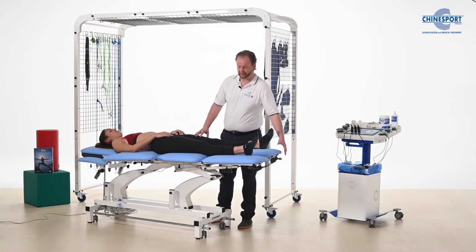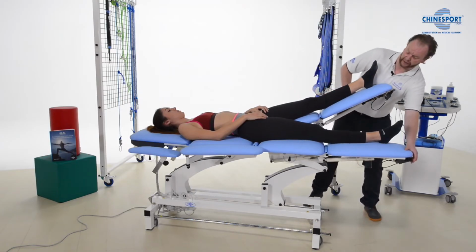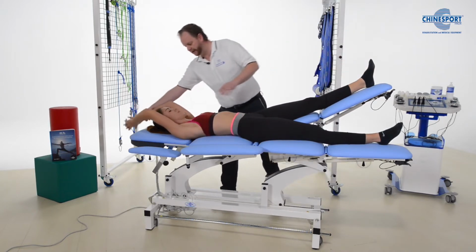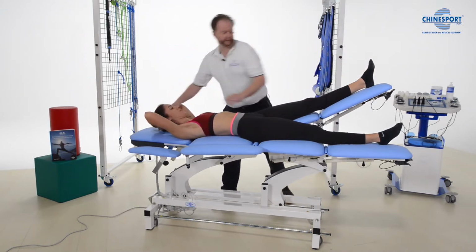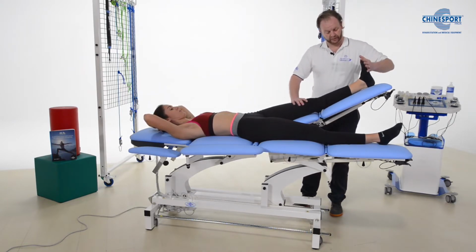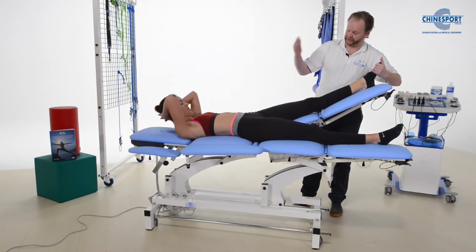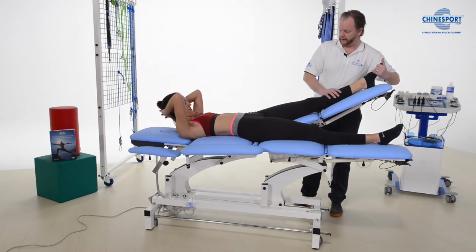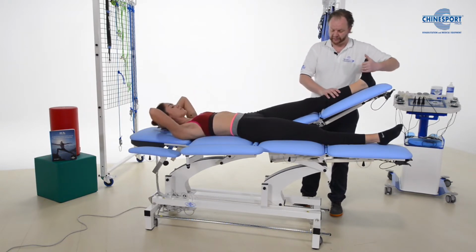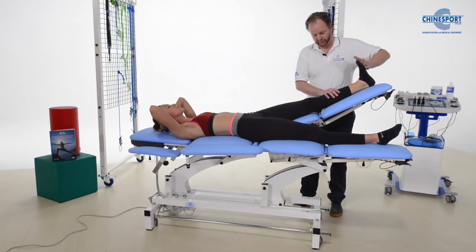So what we could do here is we could use this opportunity just to demonstrate how I would do some neurodynamic mobilizations. And if you put your hand here behind your head, what we can do is we can simply go in this direction, and then we go into the other direction, just the head up, and then just down again. And this is a very easy way to do your neurodynamic mobilizations.